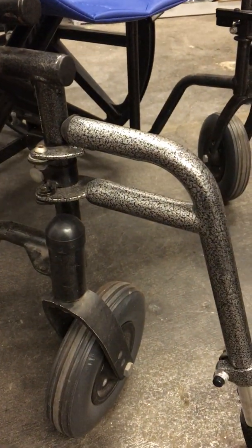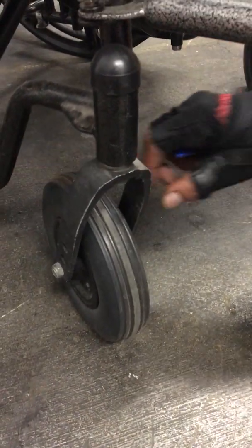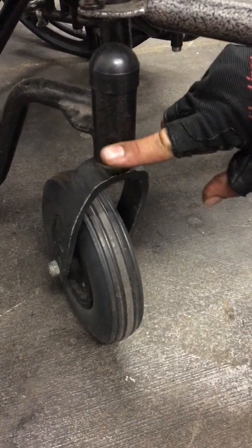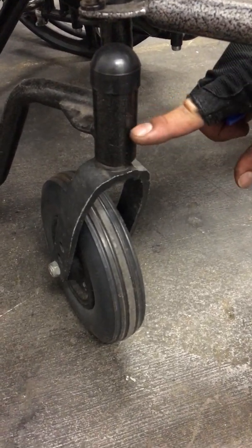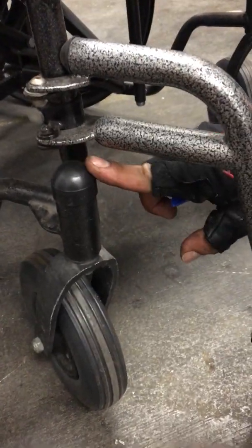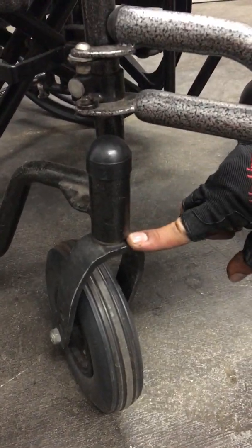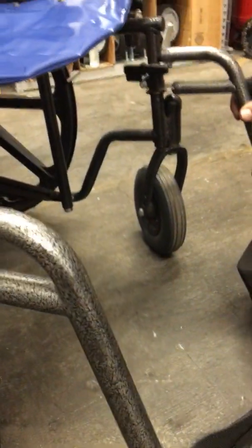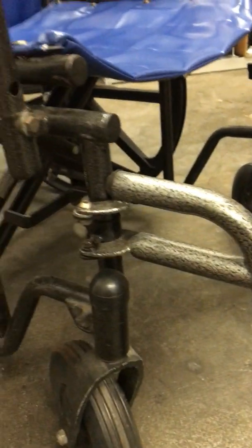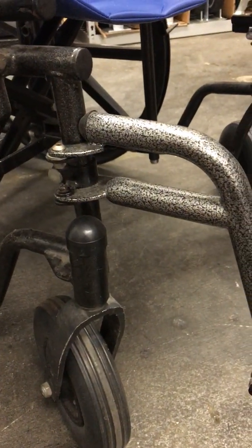Next would be the front caster. Front caster, this is totally encased, which is excellent. This should take no more than 20 minutes. However, it does get rusty, so the estimated time would be 20 to 40 minutes on both sides. And unfortunately, it can be up to an hour as well.